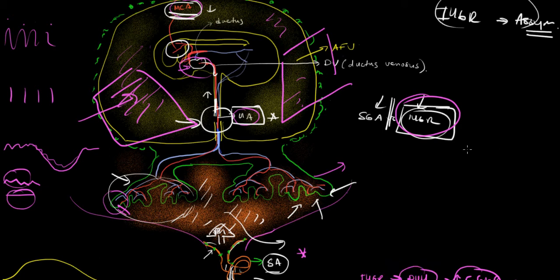And so what they started to realize is, just like it's good to have a baby's heart that doesn't decelerate when you stress it, it's also good to have a baby's heart that accelerates when it needs to. And so if you monitor a baby's heart over time, what you'll find is if the baby's not sleeping, the baby will start to move.